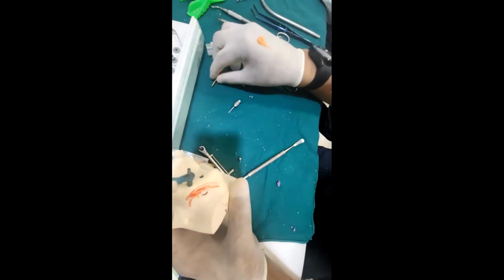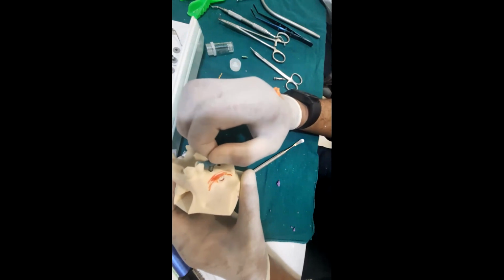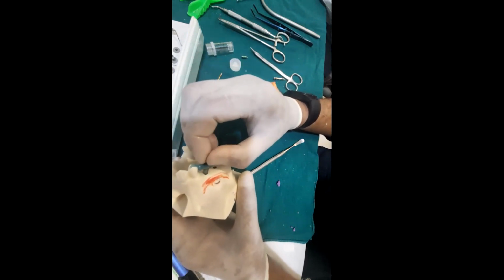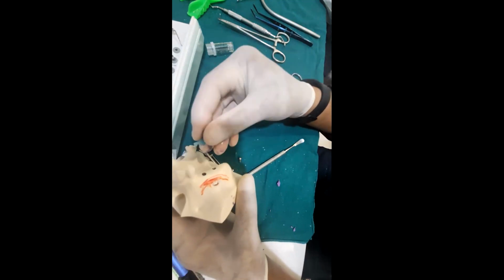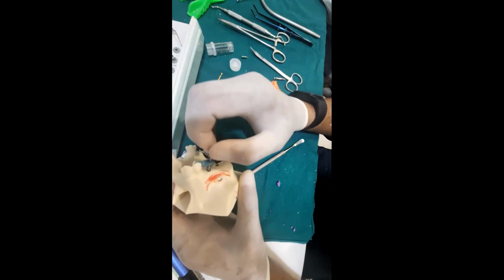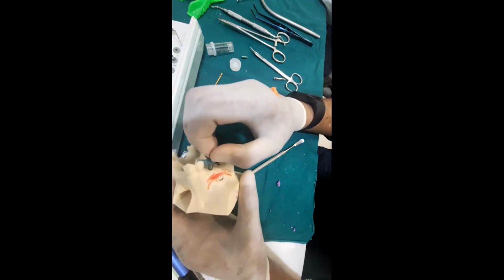But if the bond fails, then you have to repeat everything again. So I rely on the pattern resin, but there is a small drawback. It's a light cure resin, so there is a slight amount of shrinkage that you have to understand and compensate for, which over a period of time you will get a knack of if you continue to use a similar product for long.